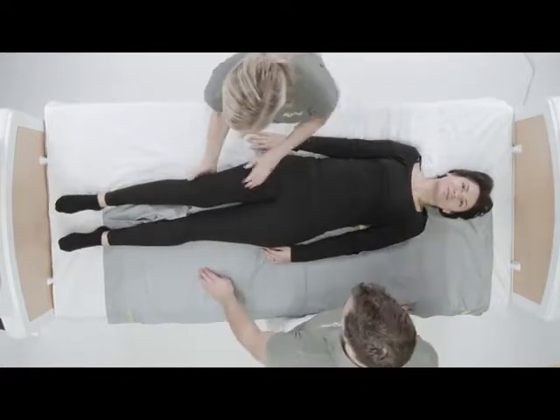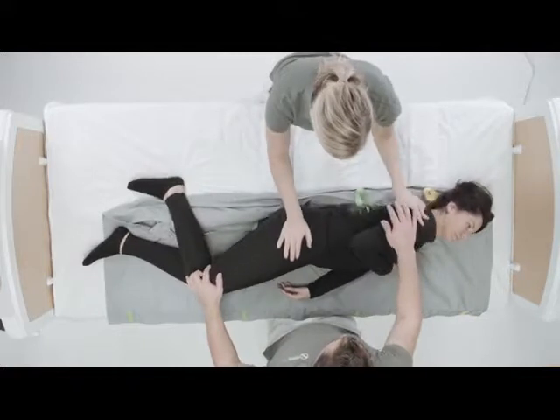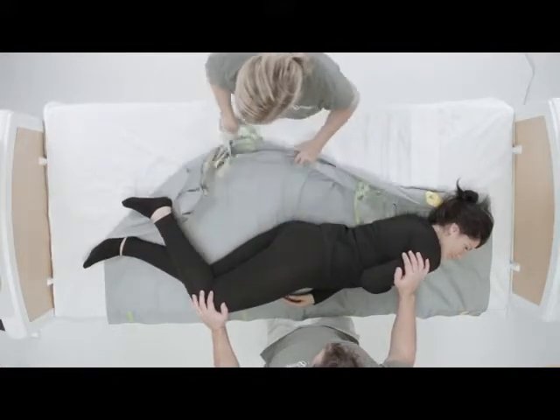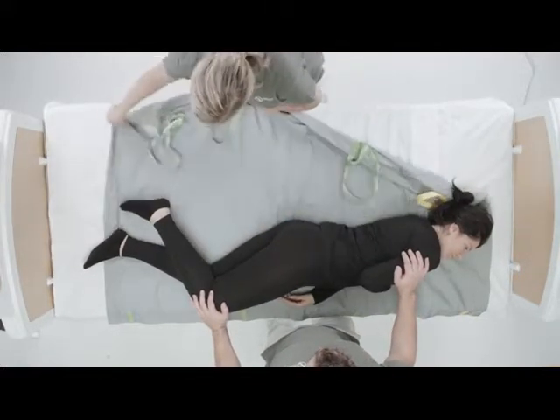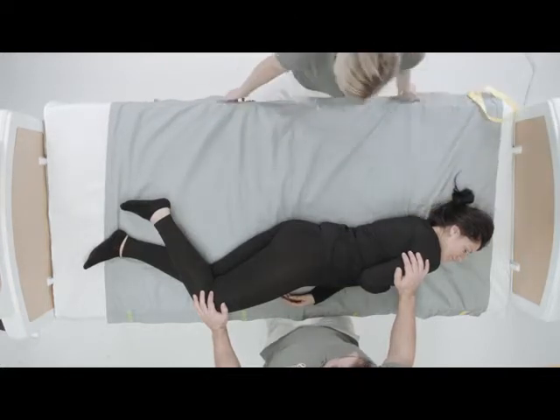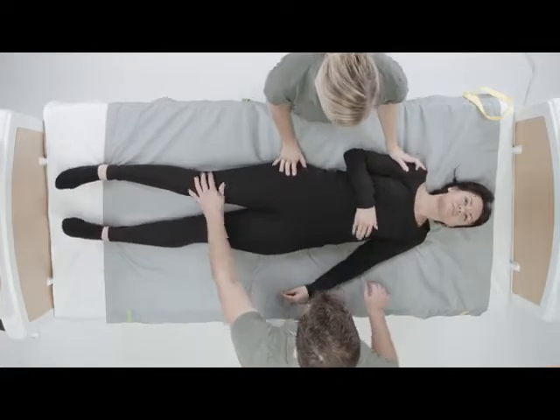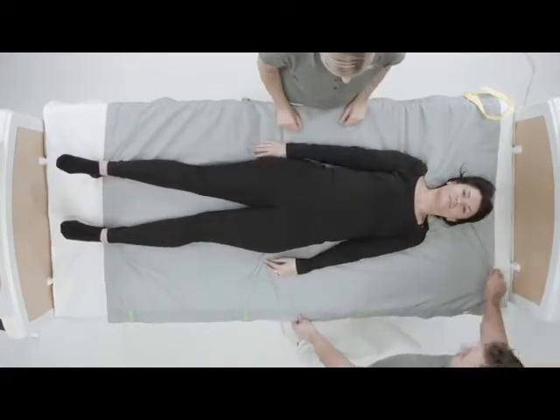Roll the patient back over onto his or her back and gently pull the edge of the sling through with the palms up and keeping the knuckles on the bed to prevent any skin shearing. The edge of the sling should be lined up with the edge of the bed, as this sling is designed to fit the width of a typical hospital bed.